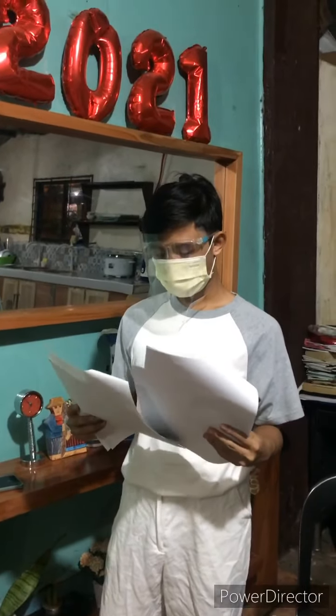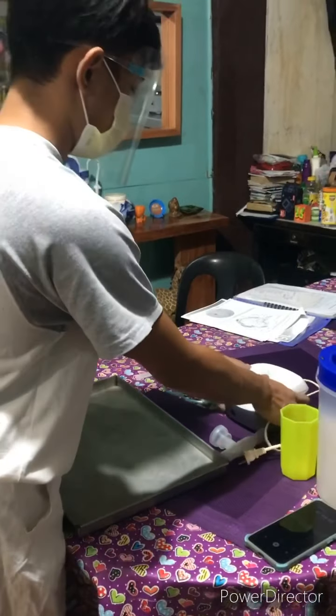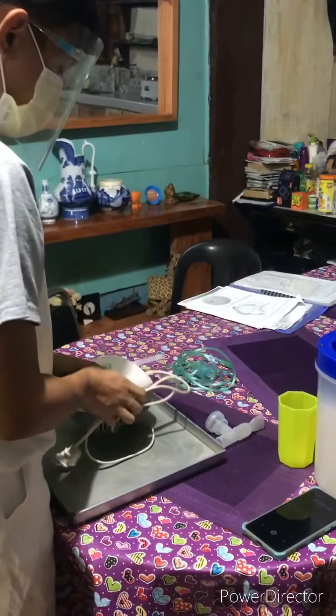Know the actions, special nursing considerations, safe dose ranges, purpose of administration, and adverse effects of the medication to be administered. This knowledge aids the nurse in evaluating the therapeutic effect of the medication in relation to the patient's disorder, and can also be used to educate the patient about the medication.